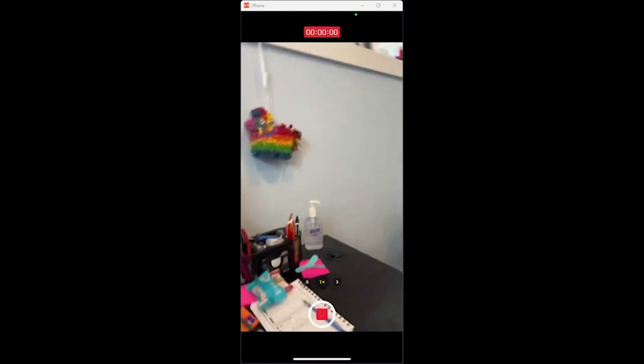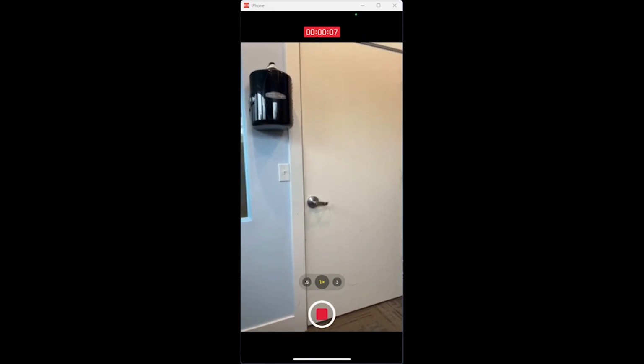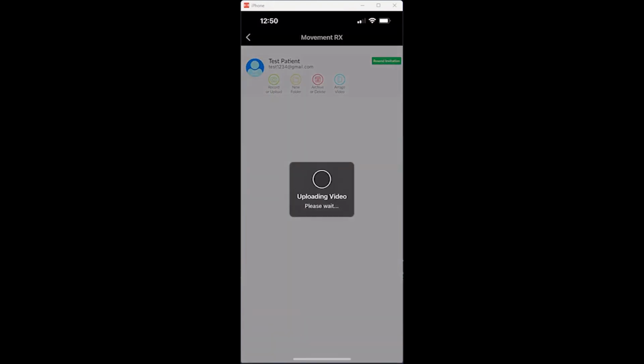Okay, now I'm going to just do a video in my office. So we're just going to say, okay, we've done in the doorway, 5 repetitions of 30 seconds of a hip flexor stretch. You can see my messy office here. Videos are typically between 30 and 60 seconds. The therapist is done. This is me typically recording the patient doing the exercise, or better yet, the patient recording me doing the exercise so I can be more specific and talk them through it.